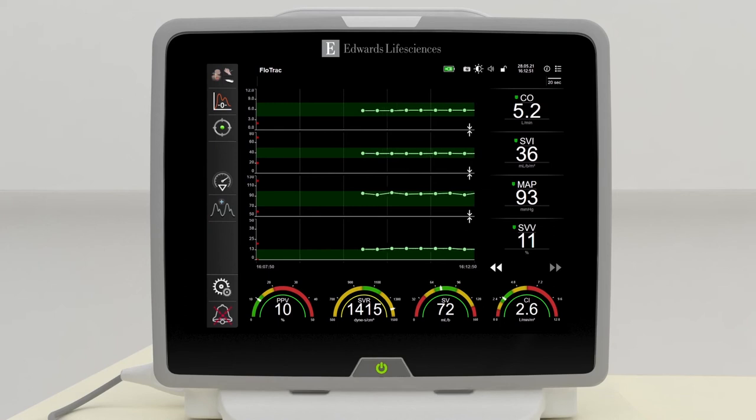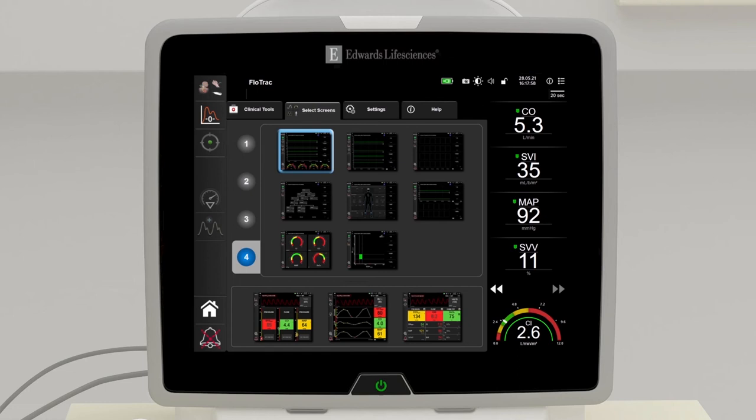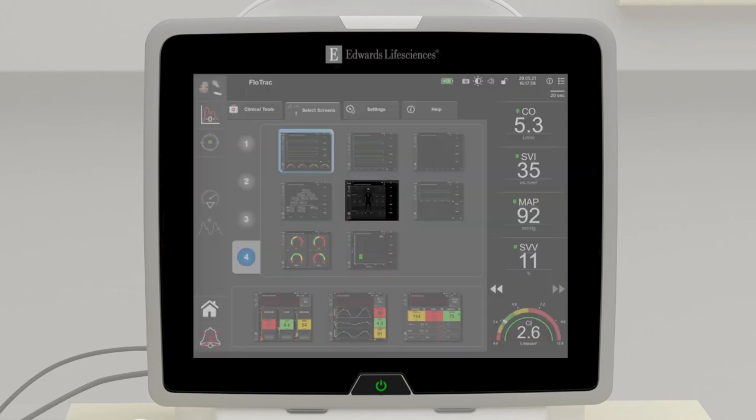Cardiac output will be displayed and will update every 20 seconds thereafter. View screens such as graphical trend screen, animated physiology screen, and cockpit screen.